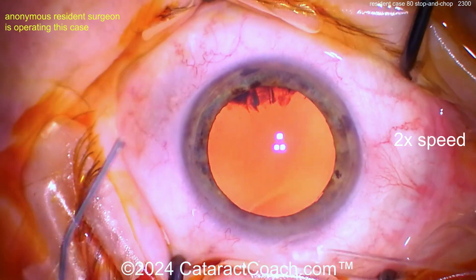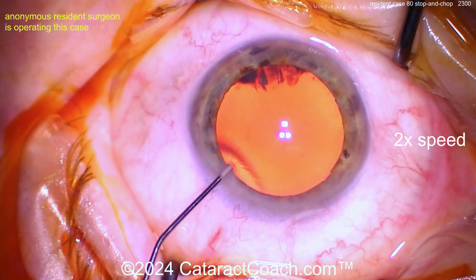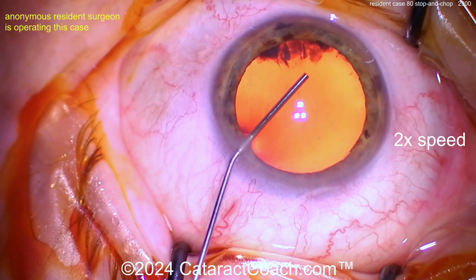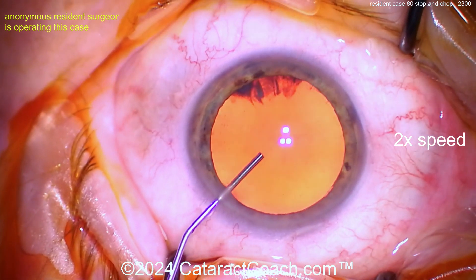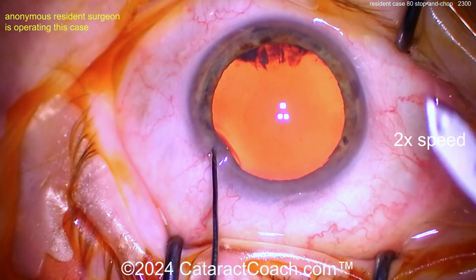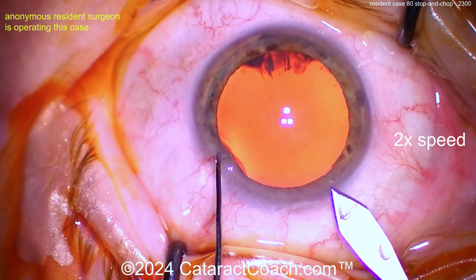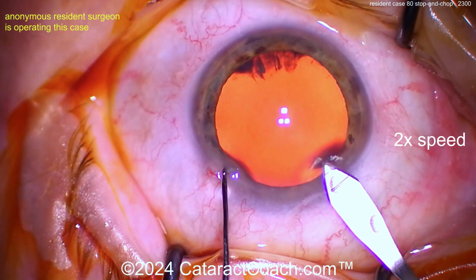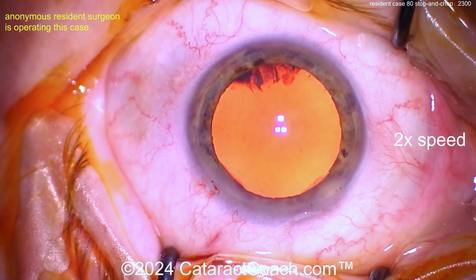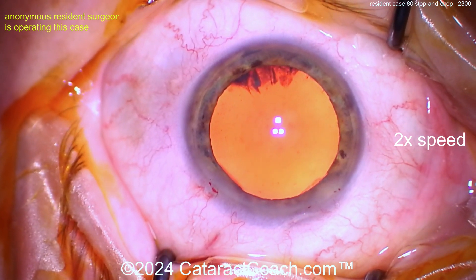That looks good. Here comes our viscoelastic — coming across, struggling a little bit to get inside the eye. That's pretty good. Big fill of viscoelastic. Now let's watch the incision carefully — using the keratome to enter. A little anterior though — it did nick the limbal vessels.